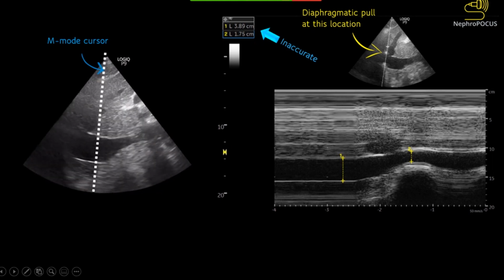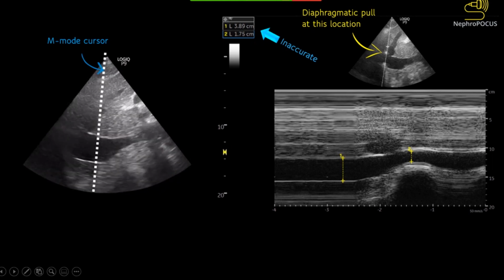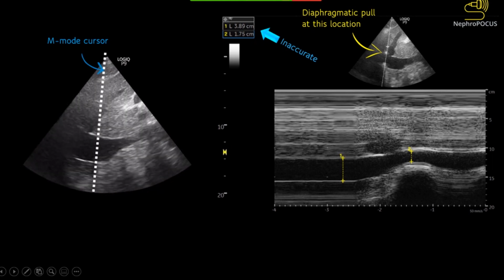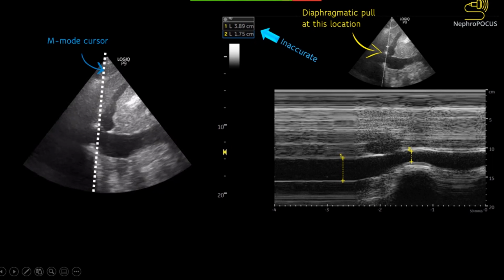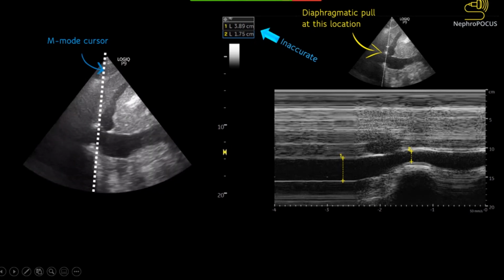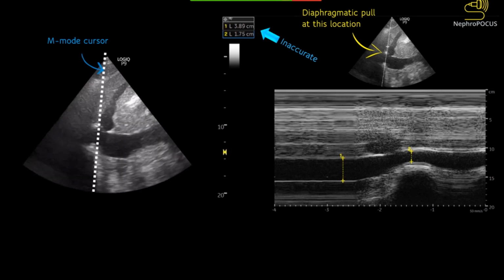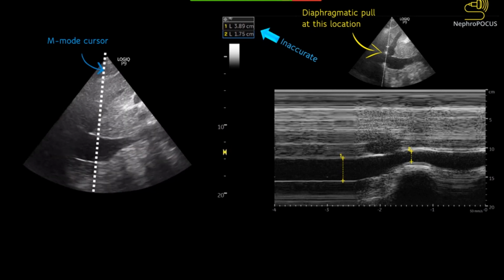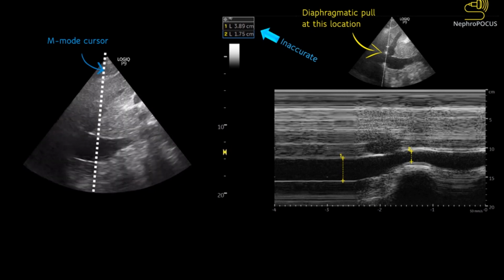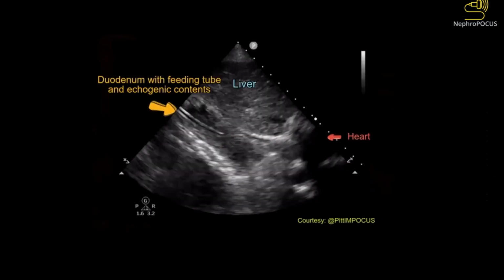When we are not measuring the same point, the final measurement is inaccurate. If we are saying the inferior vena cava has decreased from 3.89 centimeters to 1.75 centimeters here, that's inaccurate, because this 1.75 centimeters has actually come from this point and not the initial point. Also, we know that patients' respiratory effort varies depending on the situation, and not all patients have the same degree of effort, especially when they are not stable, unlike the outpatient setting we see in the echocardiography lab.